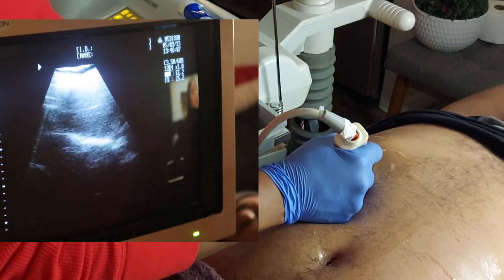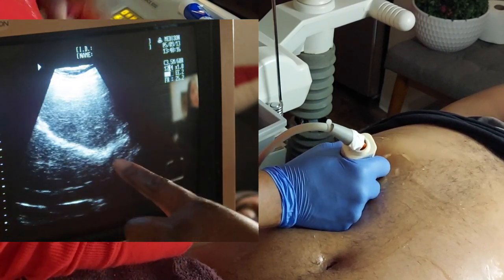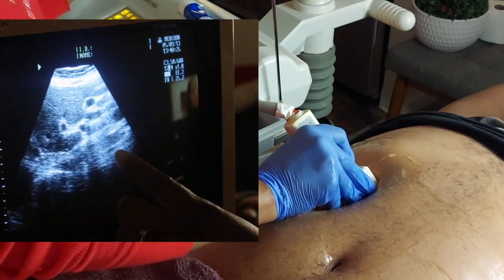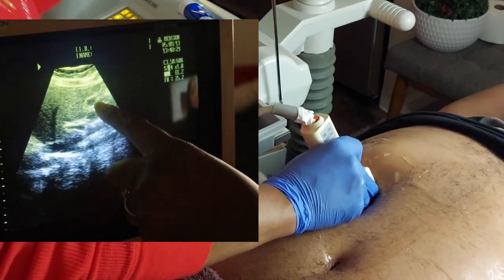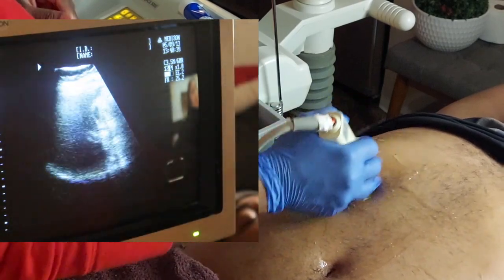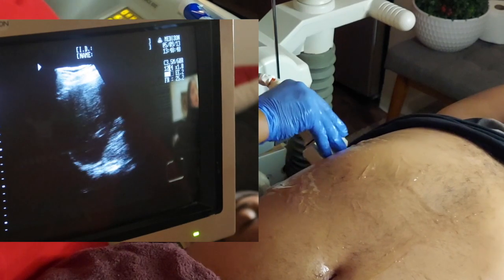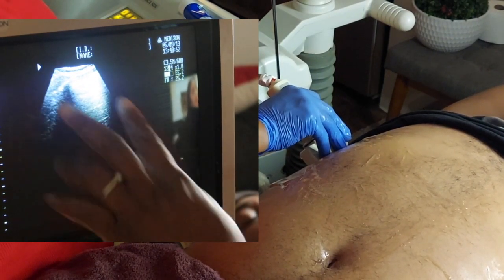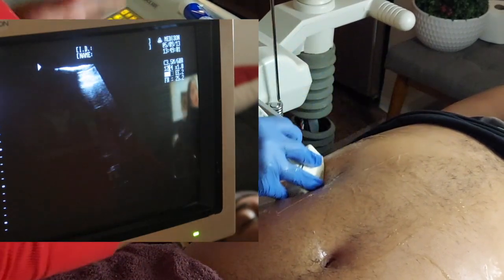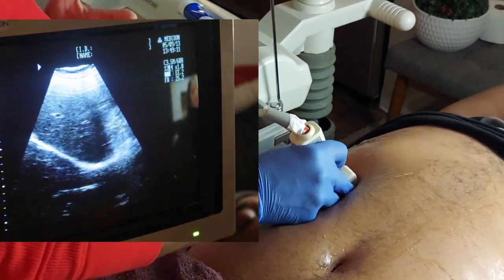So that's sagittal views. Take a deep breath in for me again and hold it. I start pointing towards the right shoulder, getting the highest part of the right lobe, and then I'm just going to scan. You see how slow I'm moving my probe — everything's just coming into view perfectly. He did eat, so this is his gallbladder and it is contracted. Here's his CBD right there above the main portal vein. You can see his IVC. So that is my one key tip for moving away from ribs — when you have that patient take a deep breath in, all your organs move down from underneath those ribs, so you're able to get under that ribcage and really scan in depth.